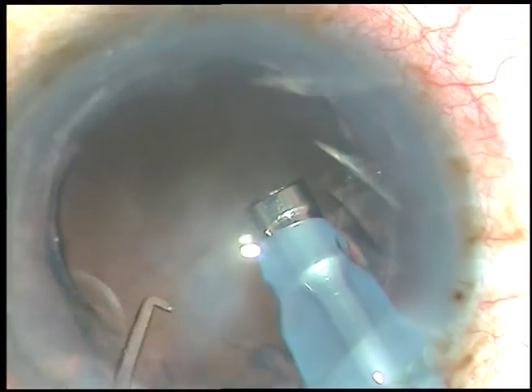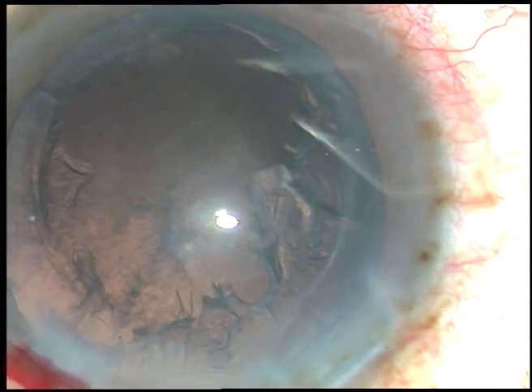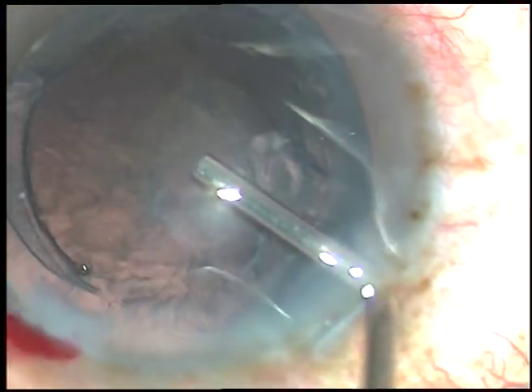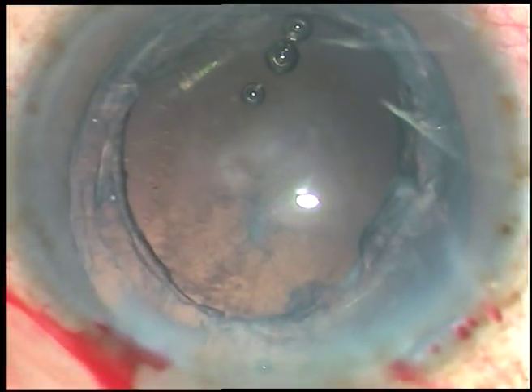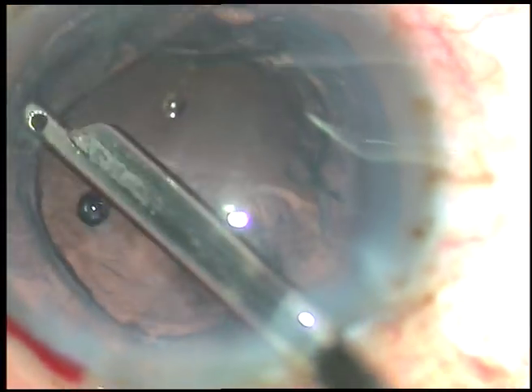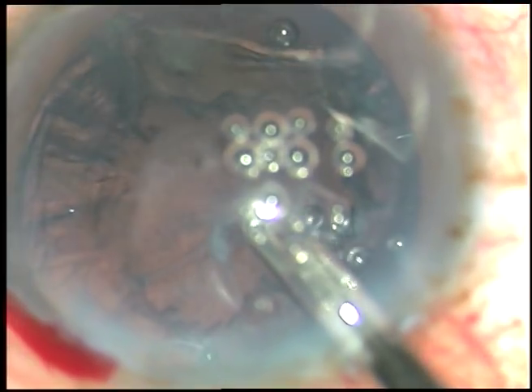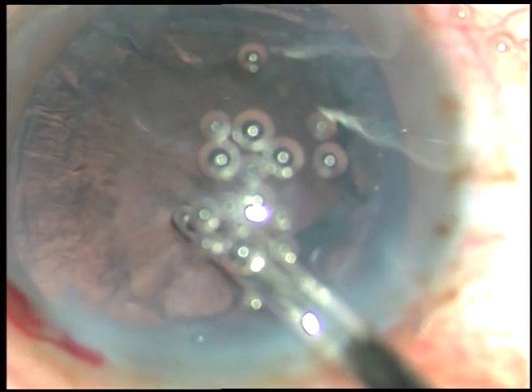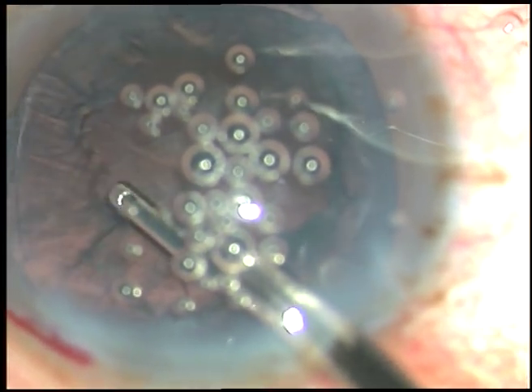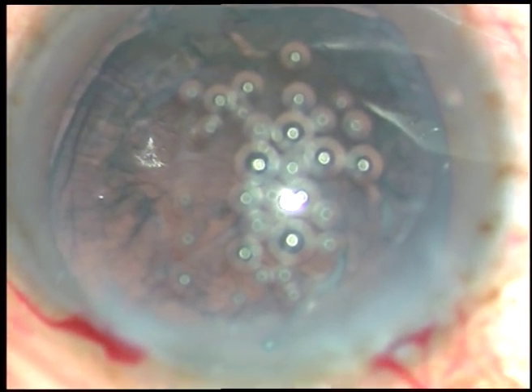And now see what happens. I inject viscoelastic substance and, as in other cases, I'm going to use a Simcoe cannula to remove the cortical matter. But remember that I didn't do proper hydrodissection and nuclear rotation. As I pull — see — there is almost 180 degrees of zonular dialysis. So I regurgitate it. I know that I will not be able to manage this case without using a device that will support the capsular bag.